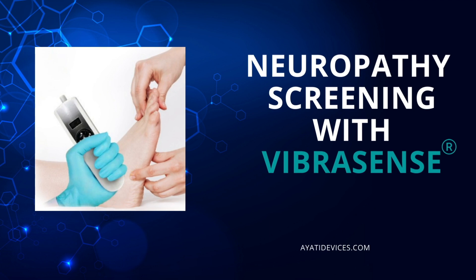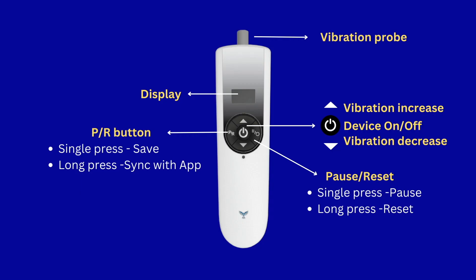Welcome to this explainer video on neuropathy screening using VíbraSense. Throughout this video we'll walk you through each step of the process. The VíbraSense device comprises the following parts: a vibration probe responsible for generating vibrations of different intensities, and a display showcasing the current testing position and the intensity of the vibration stimulus.